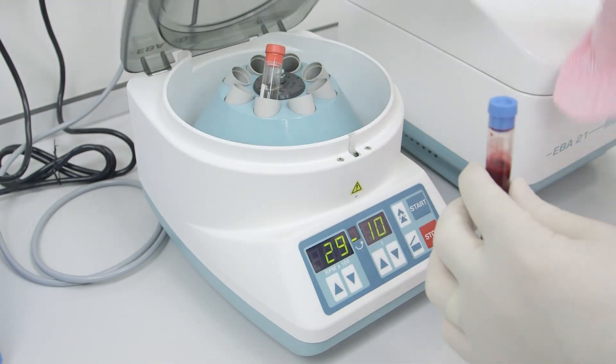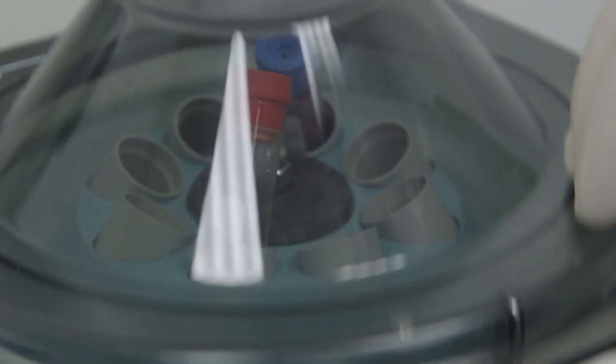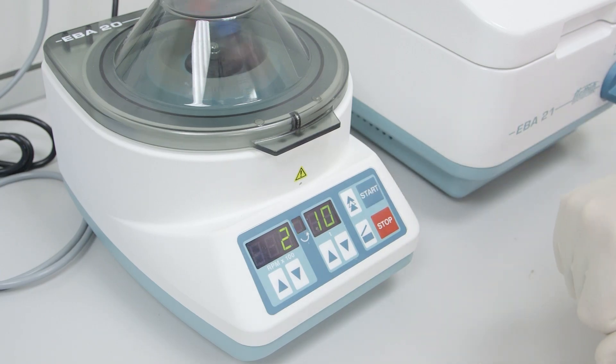This is placed in the centrifuge and spun at 1500 g's for 10 minutes, which allows separation of the various blood products.